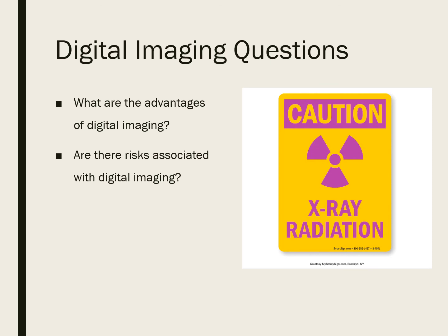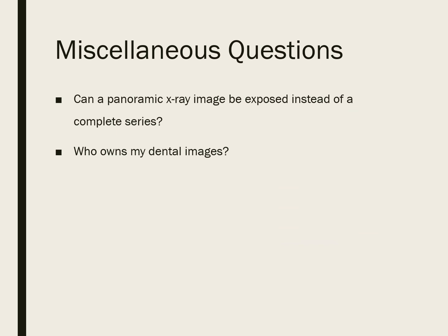All right, and here are some miscellaneous questions, which I don't think I've ever really been asked, but I might as well. So, can a panoramic X-ray image be exposed instead of a complete series? And the answer here is no. A panoramic image doesn't have enough detail, and so we have to take the intraoral radiographs in order to get that proper diagnostic radiograph.